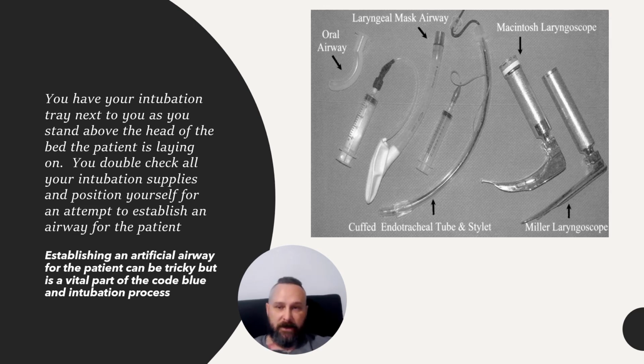If your job is the intubation, which is what we're focusing on, then you would have prepared your equipment before the patient got there in a short amount of time. You'd have your intubation tray set up at the head of the bed where the head of the patient will be. And for this, you would need a couple of main pieces of your tools, and that would be the laryngoscopes, these two pieces of equipment right here. You have your handle and then your blade, and right here is a little light bulb. They're LEDs, you can see very well with them.